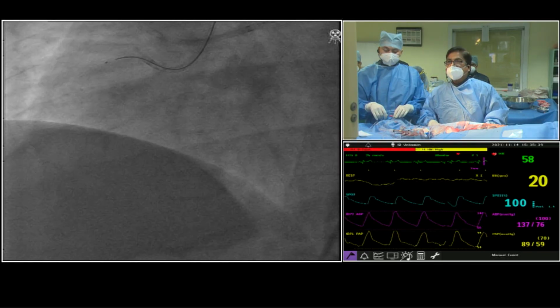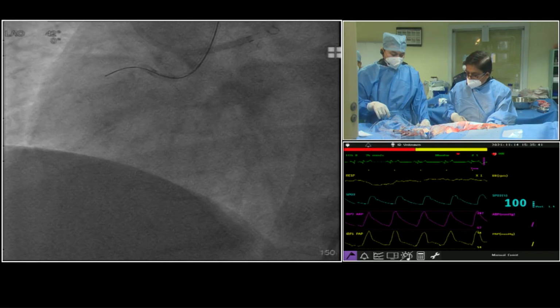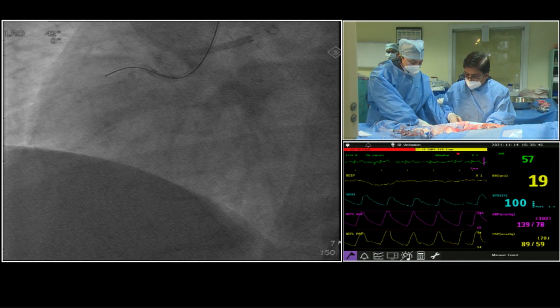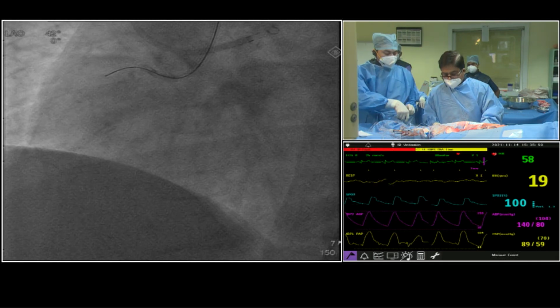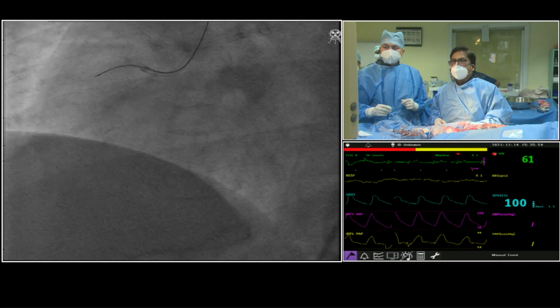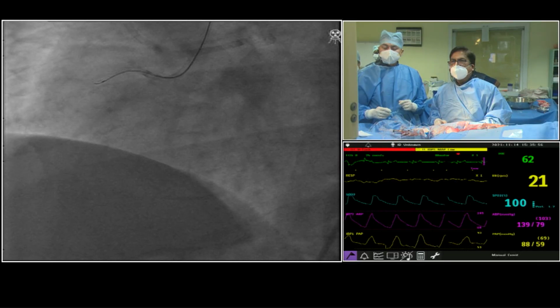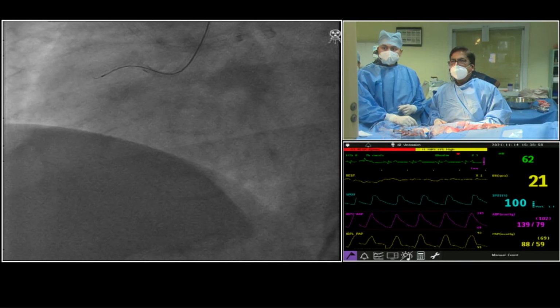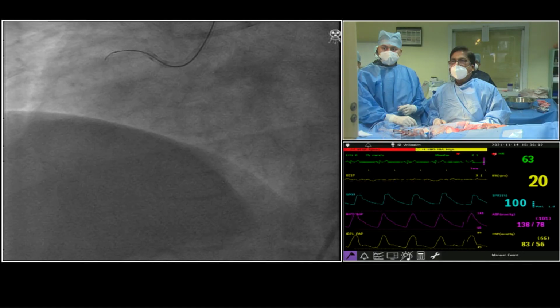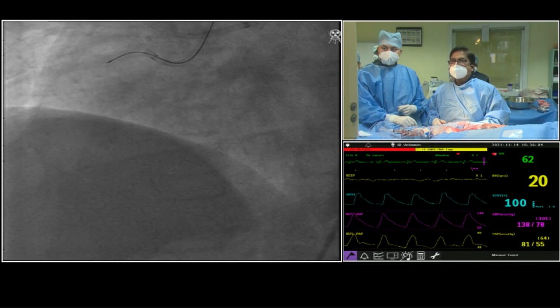Okay. AL1 is one catheter many people try, but actually with this angulation of the vessel, it is a very good catheter. SAL. He was asking everybody in the first place, can I get SAL or not? Sure. Oops. Now this side branch is creating a problem.